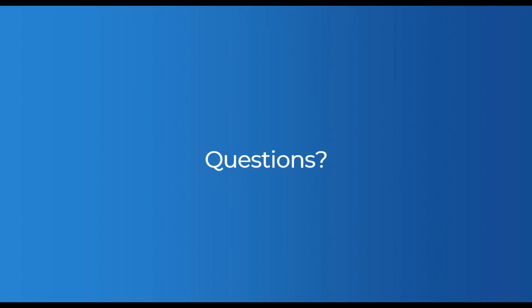So Shauna, you talked about densities and printing in different densities. I guess, what are the advantages of being able to do that with a 3D printed brachytherapy applicator, and what are the different densities or infill that someone could print at? Yeah, so it's quite interesting actually because, as a sub-study, we had a little look at whether the infill density, and ultimately the density of the applicators themselves, would have an effect on the dose distribution that we achieved.